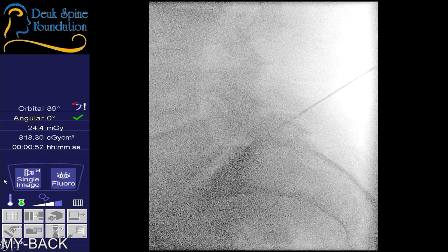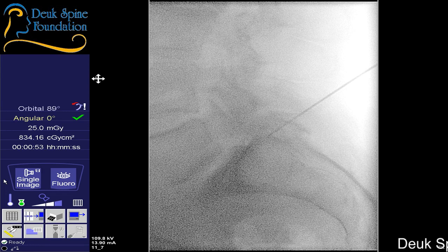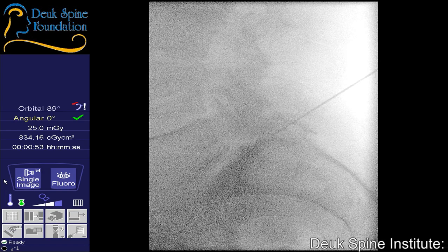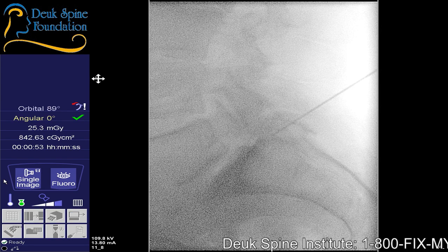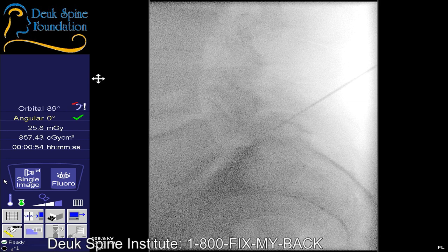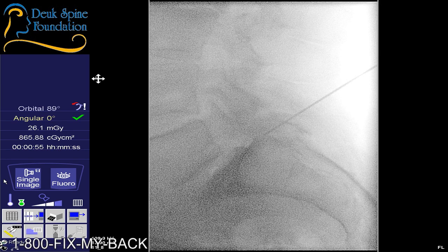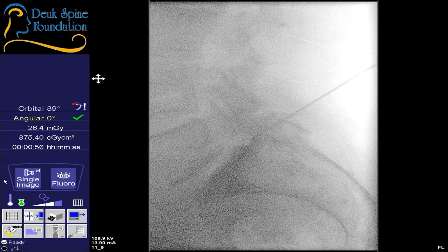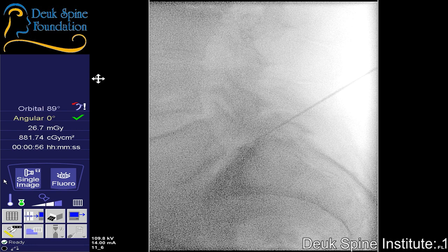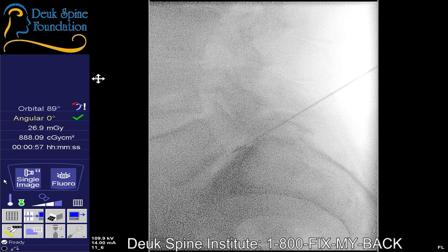Shot. That's the low facet. Shot. There's that scar tissue. Shot. Tons of scar tissue. Shot. AP.